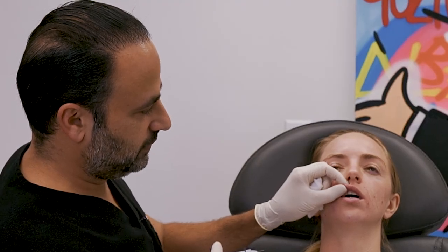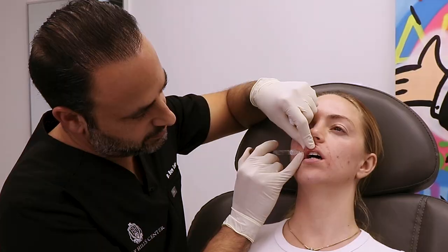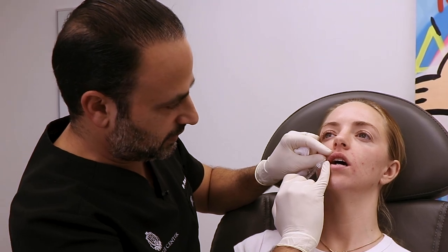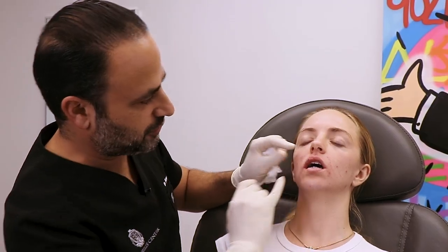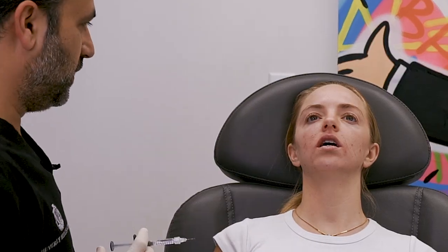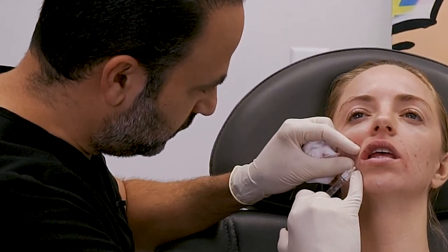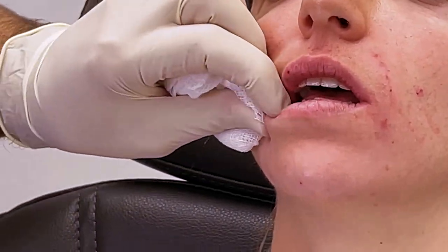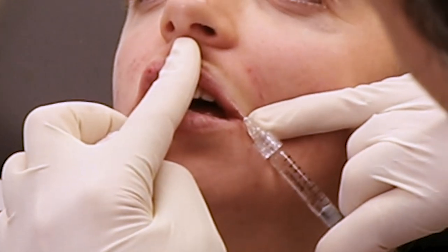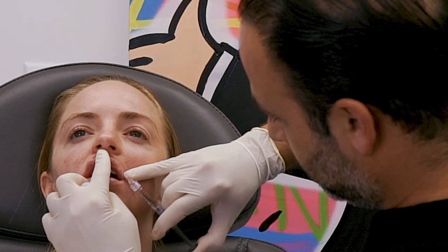You don't want to massage much, just a little — if you massage too much it can migrate. I'm going to go downwards a little bit to get into this crease and put a small amount of volume there. You don't want to take too long injecting because the lip gets swollen and then you can't match up the sides. I'm putting a little bit to give a touch along that top border. She does not need much more. I'm going to put a little into the chelion — she has a little fissure over there. Fissure's gone. Same thing on this side: stretch it, push it towards yourself, come in laterally, inject just a little tiny bit making sure it's not migrating anywhere we don't want.